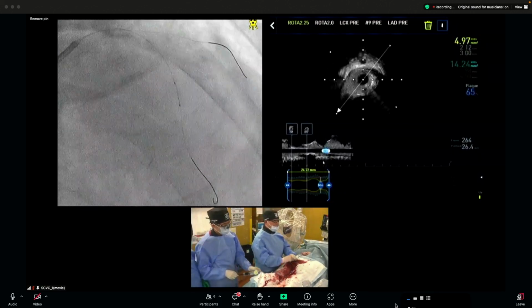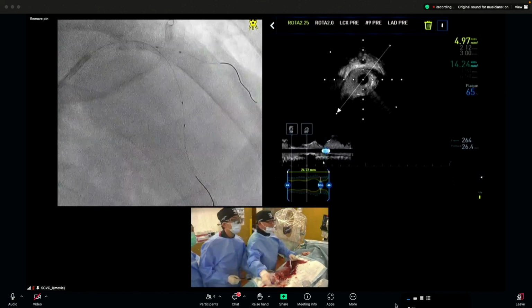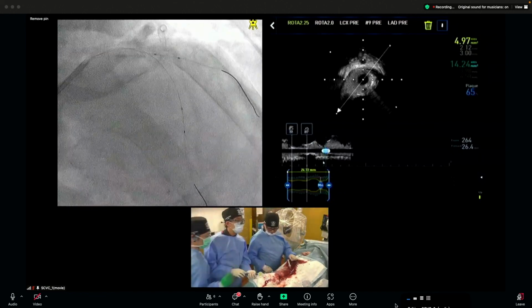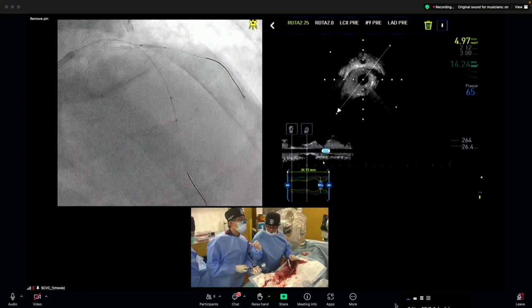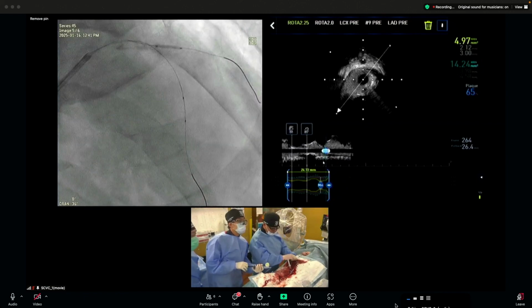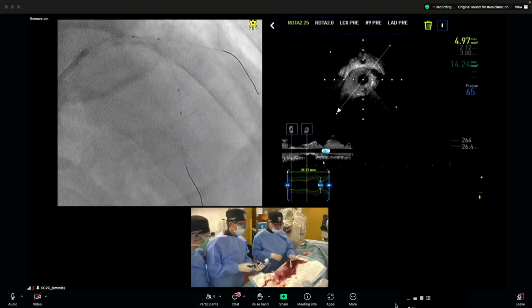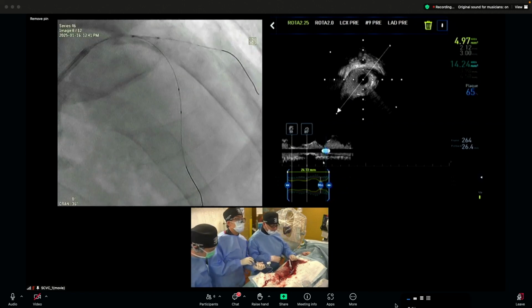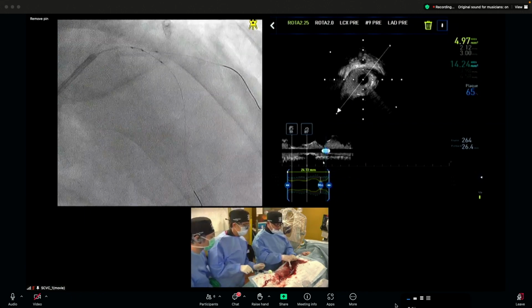So I think there's a consensus statement from SCAI probably last year that for selected cases, some people actually put in 2 guide wires, one in the main branch, one in the side branch, and then they use a microcatheter or guide extension catheter to protect the side branch guide wire, and then use the rotablation to rotablate the main branch, while keeping the guide wire and the microcatheter in the side branch. Of course, sometimes you need to move the microcatheters, change the position after each rotablation, trying to avoid persistent ablation of the microcatheters. I never tried that.